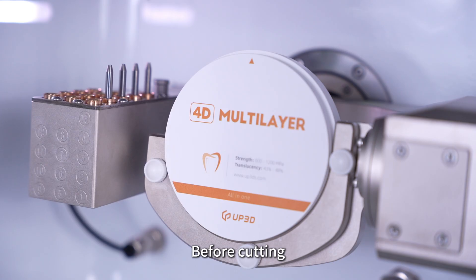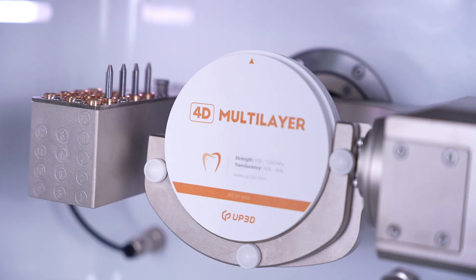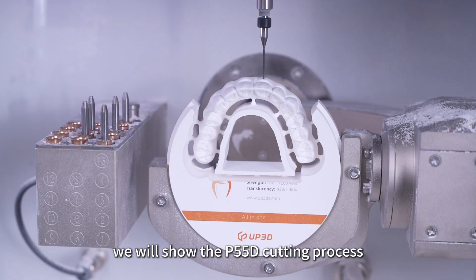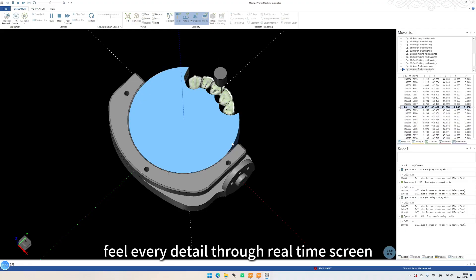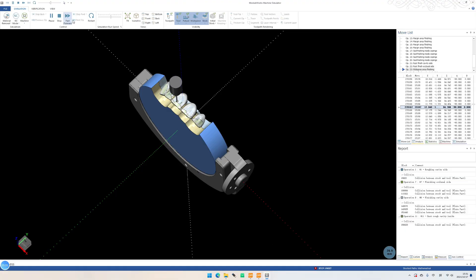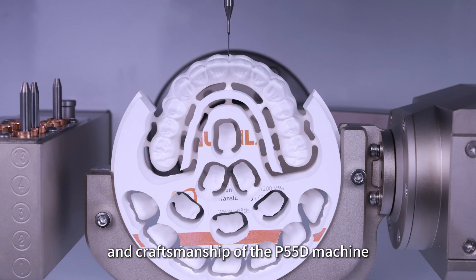Step 12: Before cutting, carefully install the required material to ensure that it is stable and meets the milling requirements, so as to lay a good foundation for the subsequent steps. Step 13: We will now show the P55D cutting process — feel every detail through the real-time screen to ensure accurate and efficient milling. Step 14: Presenting the finished product, the perfect repair demonstrates the excellent performance and craftsmanship of the P55D machine.